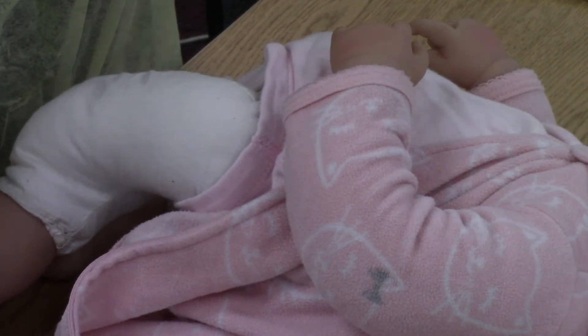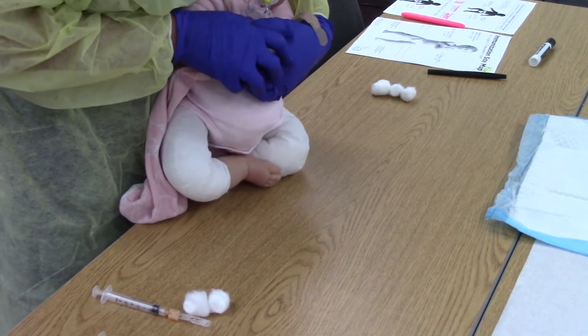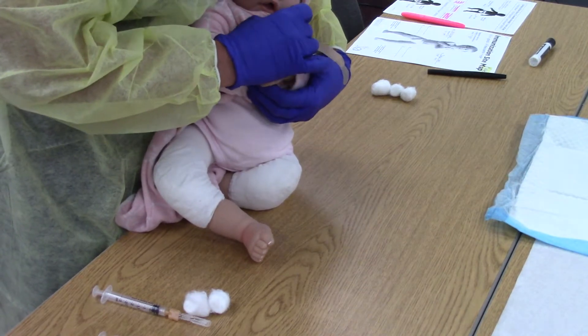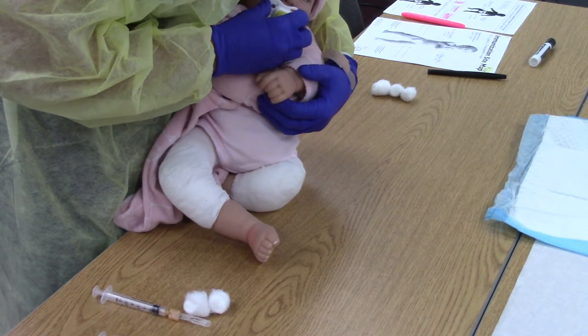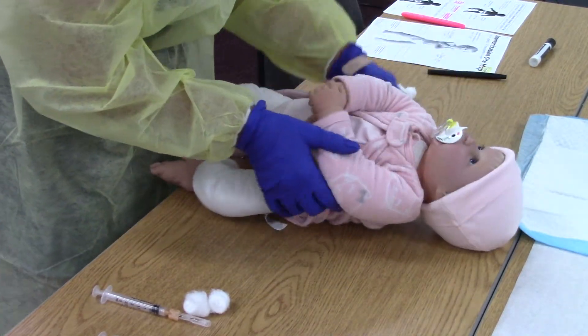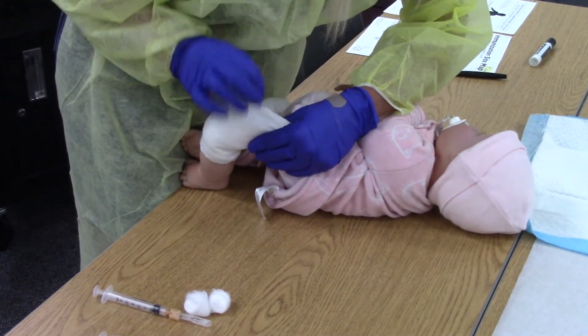Sometimes parents will hold the baby on their lap — they would hold the baby like this, taking the arms and just holding the baby. Generally you'll have an assistant or the parents will help, but sometimes you have to do it alone: cross the baby's leg, hand over, and grab. You have to be really fast.